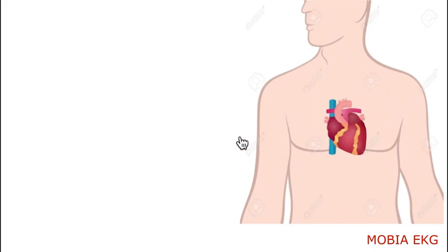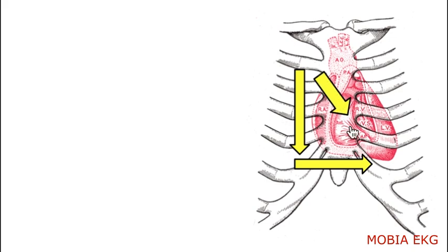The heart is divided into right and left parts. These two parts are not symmetrical anatomically, and also the heart is not located 100% vertically. The location of the heart inside the chest cavity goes from the top to the bottom, from the right to the left side, and from the back to the front.